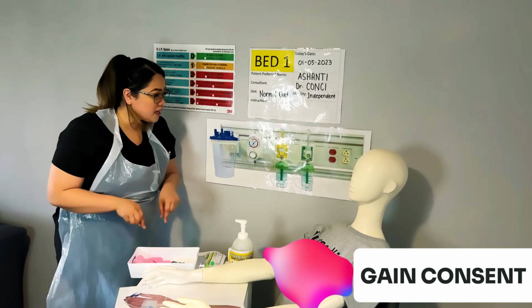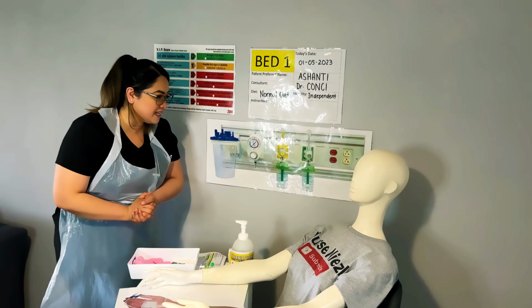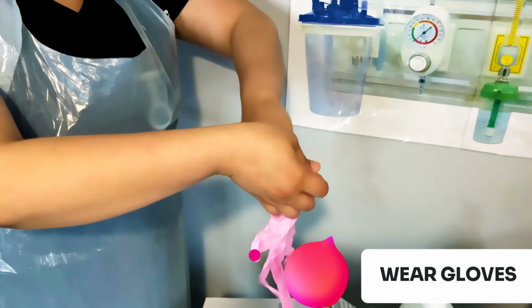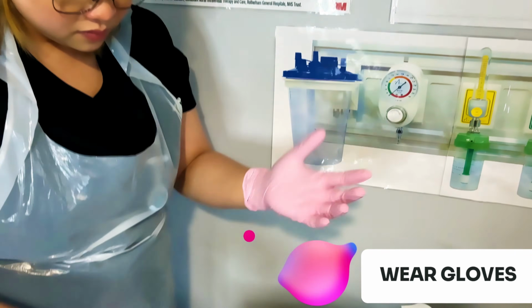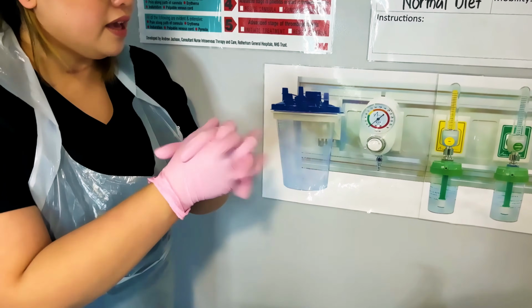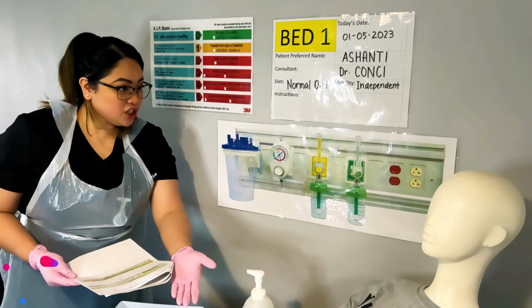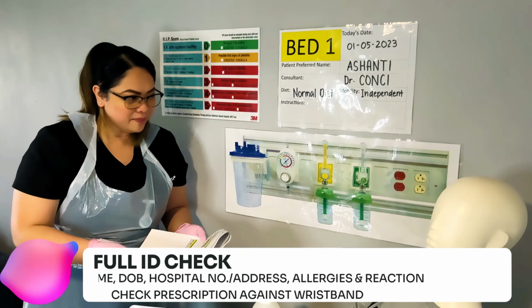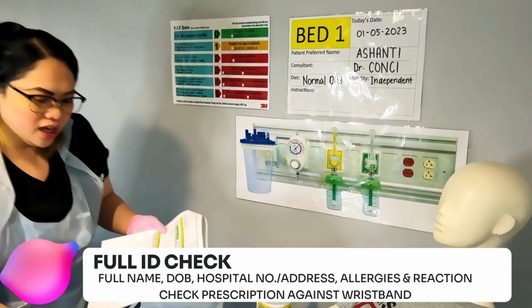Okay, but before I start this, would it be okay if I just check your ID? Yeah, sure. Okay, let me just put on my gloves. Would it be okay if I touch you? I just need to compare your prescription with the wristband, if that's alright. Yeah, sure. Okay, can I have a look?